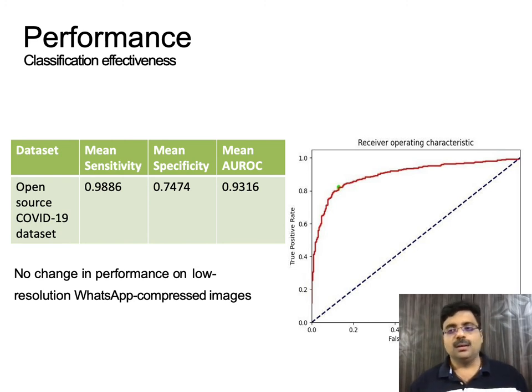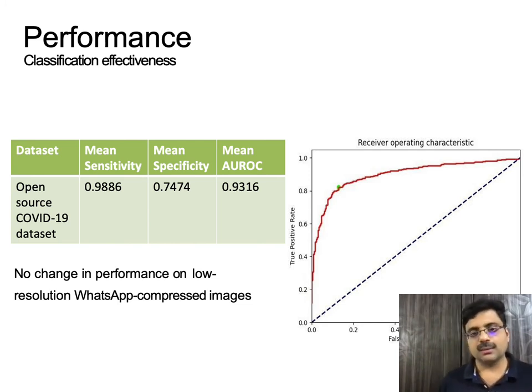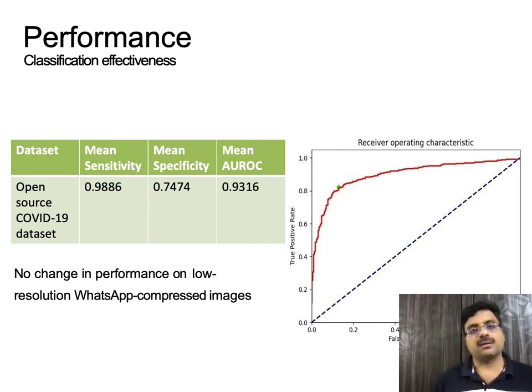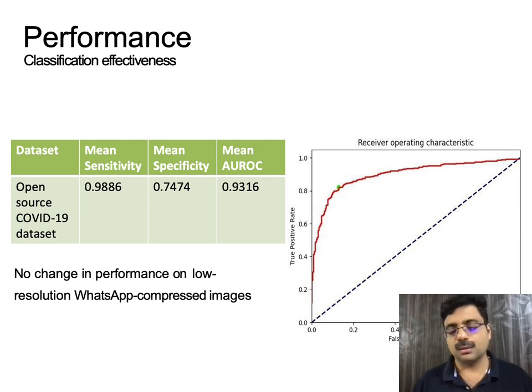effectiveness standpoint. People needn't spend on expensive tests. They don't get diagnosed incorrectly. They wouldn't spend on expensive tests, and testing kits would therefore be more available to people who really need them. So we definitely are continuing to work on improving the specificity of the model while not regressing on the other metrics.